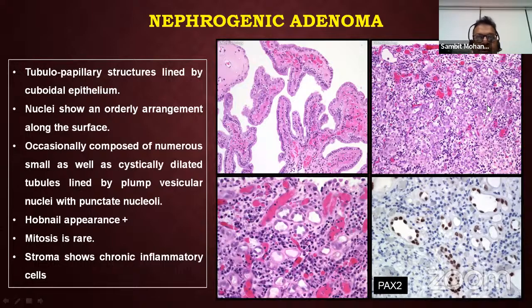So the nested subtype of urothelial carcinoma, prostatic acinar adenocarcinoma, and clear cell carcinoma of the bladder. But what you see in these lesions is that the cells look alike. There is no nuclear atypia, number one. Number two, even if they are infiltrative, you do not see any mitosis or necrosis or retraction surrounding these structures. Retraction is a feature of invasion in bladder pathology. That is not there. Again, the overlying urothelium looks normal, number three.